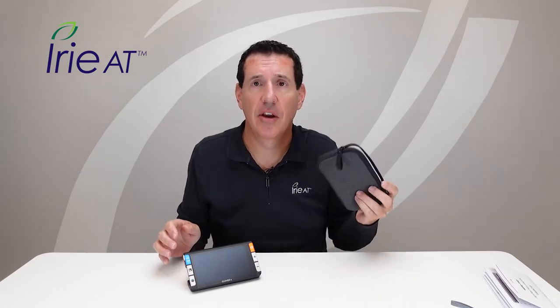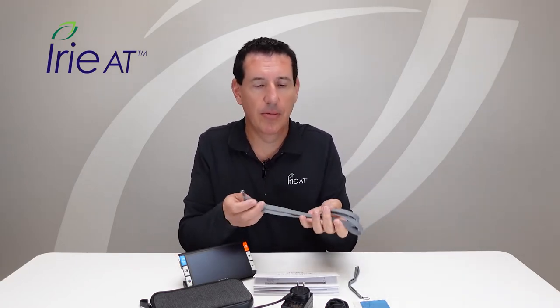So inside the box, besides the Clover 6 video magnifier, you get a carrying case — a nice carry pouch — also the product manual showing you how to use the device, a power cord to plug into the wall and into the device to charge it, an HDMI cord for plugging into a larger screen, a cleaning cloth, and a small wrist strap as well as a full-on neck strap. Pretty cool — quite a few things in our little treasure box.